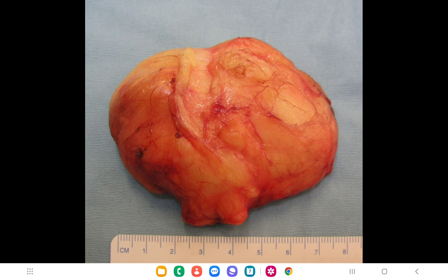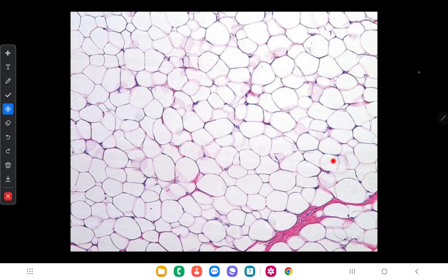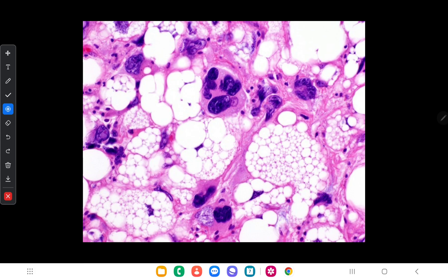Here is another picture of lipoma and a microscopic view showing mature adipocytes with nuclei pushed to the periphery and no atypical shapes. Here is a microscopic view of liposarcoma, composed of atypical adipocytes called lipoblasts, which are atypical adipocytes present in different sizes.